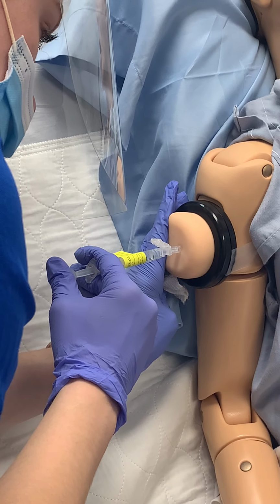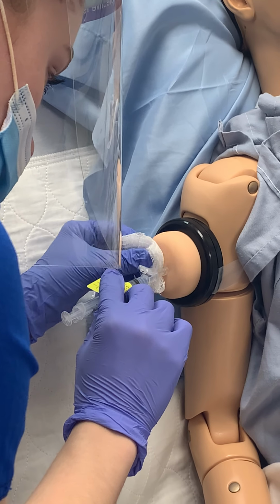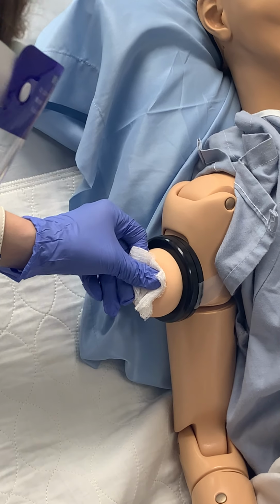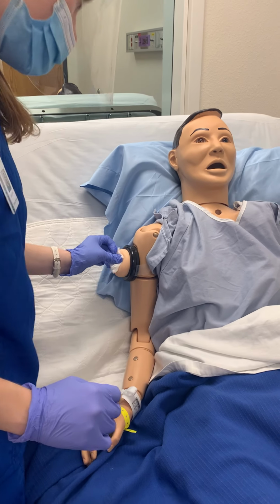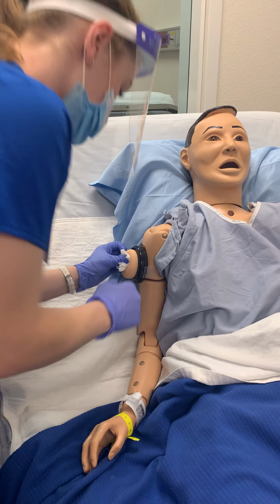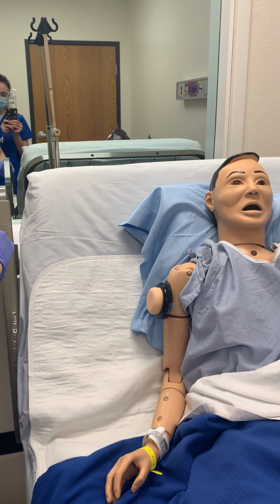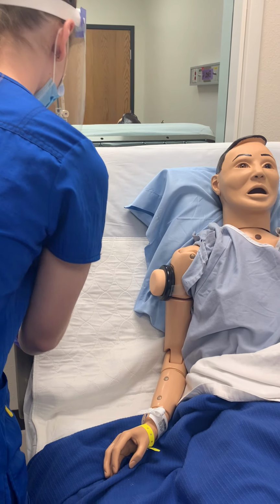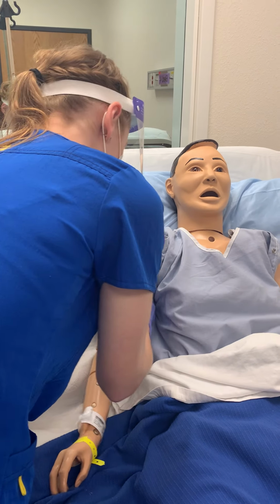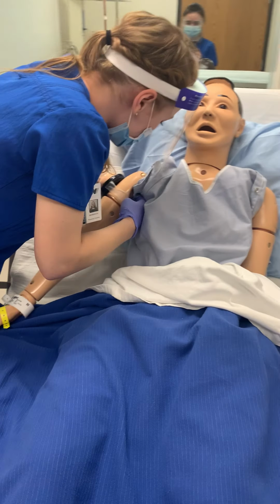And then we're going to slowly inject. And then I'm just going to leave that there for a little bit. And then we're going to take out. And I'm going to put my safety on. And I'll throw this away. How are you doing, Shirley? You doing good? Okay, perfect. Okay. Let me make sure you're not bleeding. Okay, you are not. So, if you were, I would have helped you put a Band-Aid on, but I'm gonna put this back up, and then Shirley, I'm just gonna be moving down to your skin, so I'm gonna be doing your TB next.